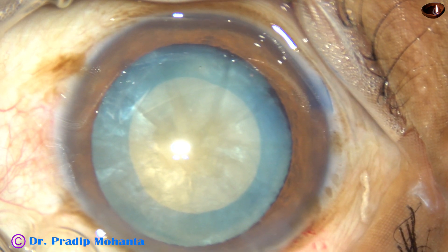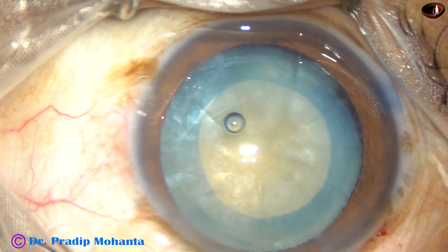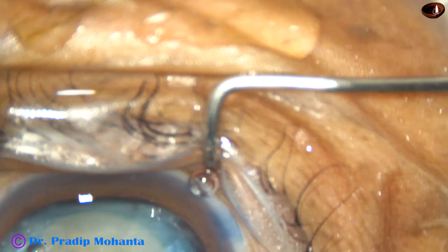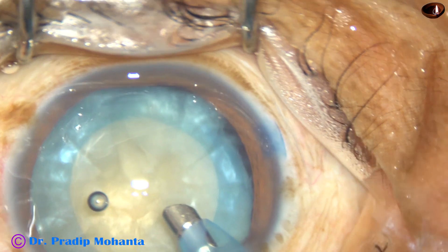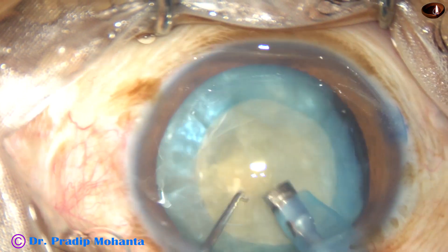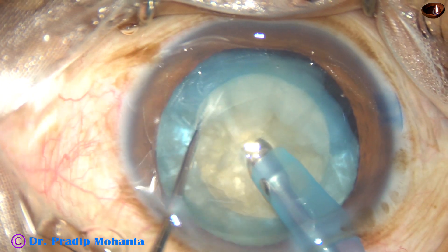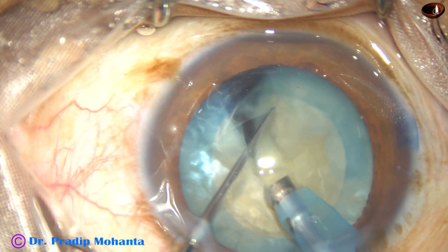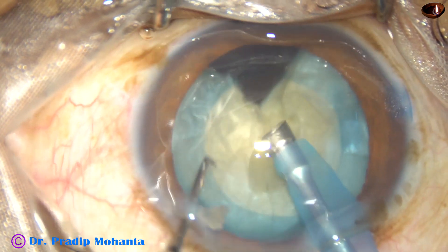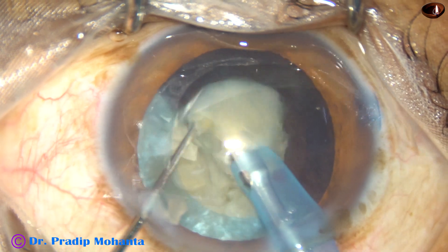And now it's time to manage the nucleus. The machine being used is the Oertly Cataract 3. The phaco needle goes inside the anterior chamber. The handpiece is turned and the bevel is now towards the cornea. This is direct chop — bury the tip into the substance of the nucleus. Hold the nucleus very firmly and chop. Hold it at another place and chop again. Free nuclear fragments may be emulsified either as they are made free or later.